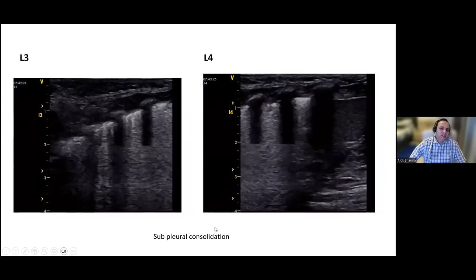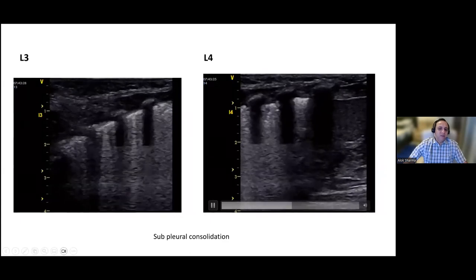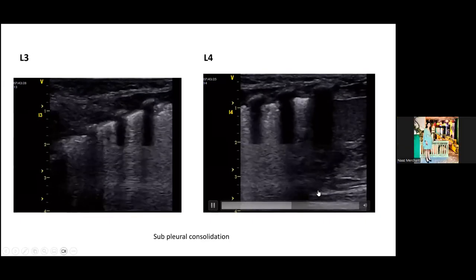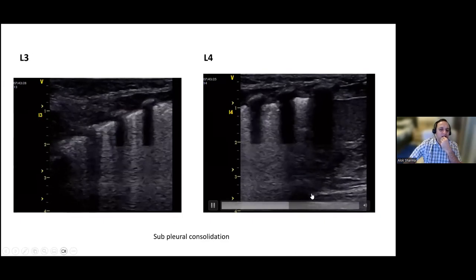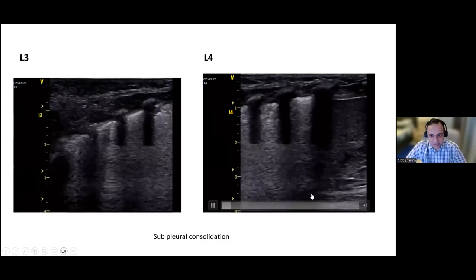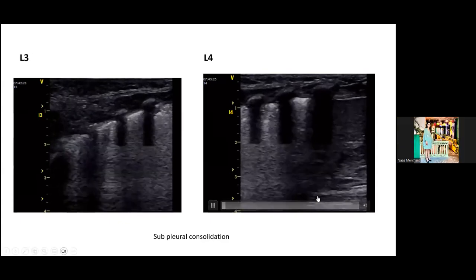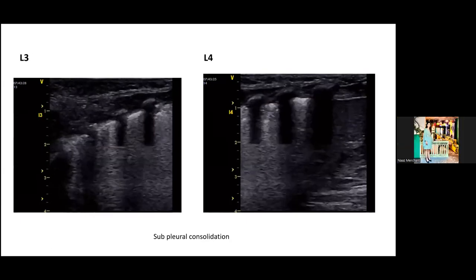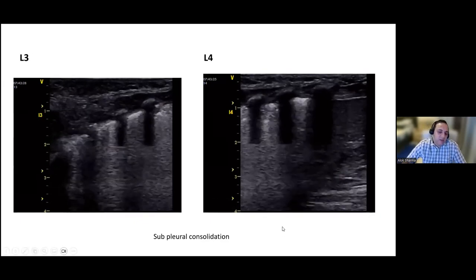So just L4 again, can you see that lower region? If you go to the lower region of L4, you've got a very sharp triangulated region. That's the diaphragm. Can you see how dark that region looks? Now, again, the question is, is that a mirror image artifact or do you have focal atelectasis over there? Because you've got a tissue sign. It could be a mirror image artifact, but it's just interesting. You've now been able to demonstrate this twice in the same region. So it does raise the possibility of an occult lung atelectasis. Now, how do you differentiate this? I will go through it today. I think you do have a little bit of lung atelectasis there, and I'll be showing you lots of images.